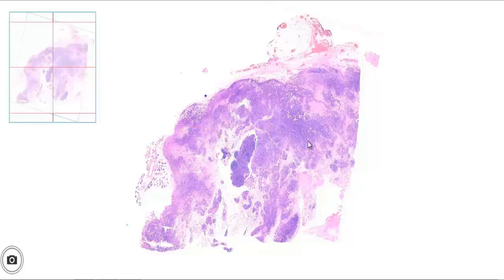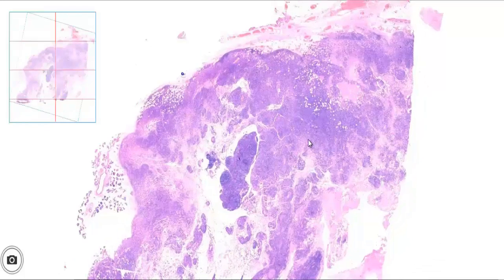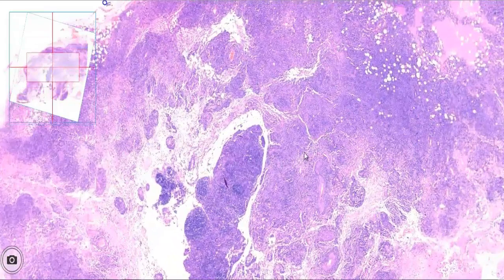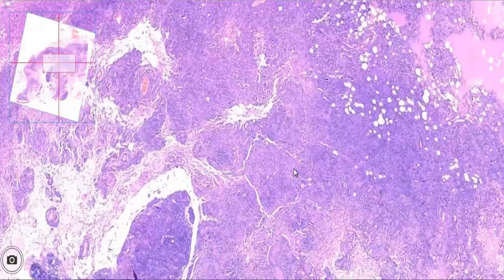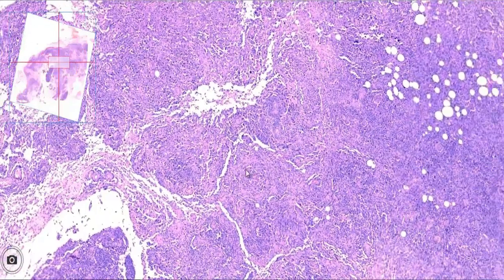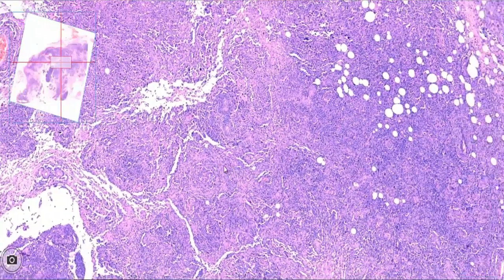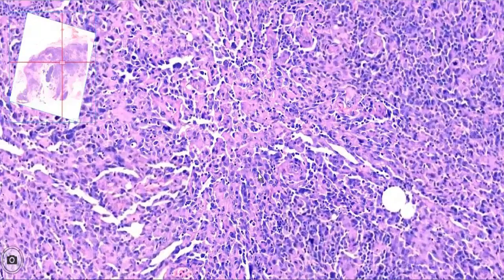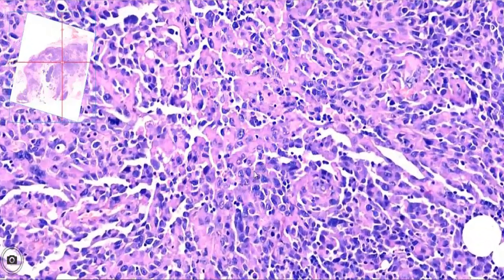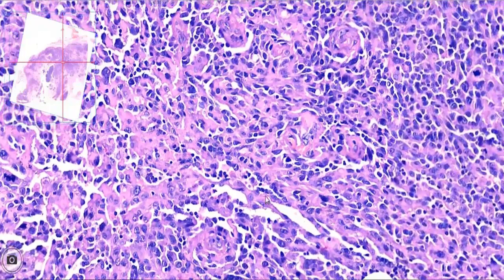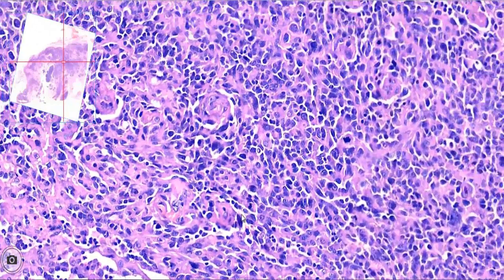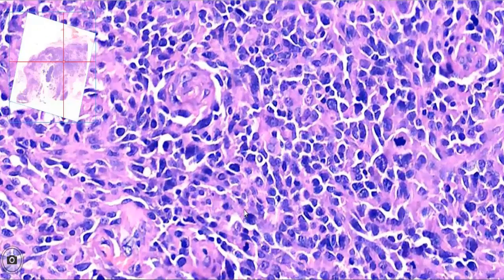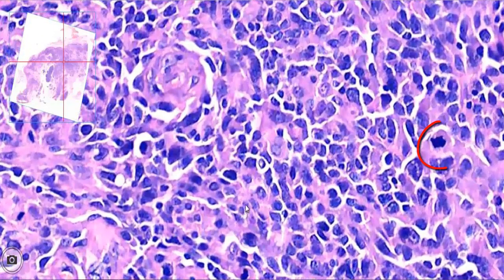On zooming in on the solid area, we see that the tumor is made up of round malignant cells which possess abundant pink cytoplasm and are arranged in sheets. Mitotic activity is highly increased and prominent nucleoli are present in the nuclei. Here we see a mitotic figure and here we can see prominent nucleoli in the cells.